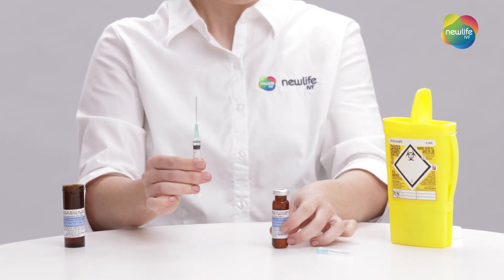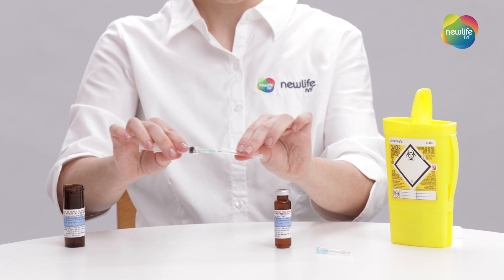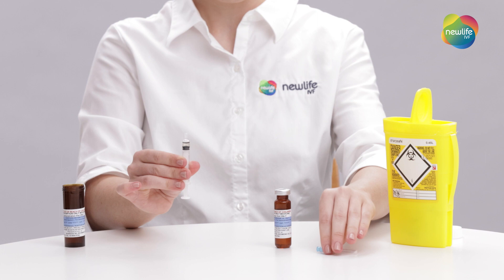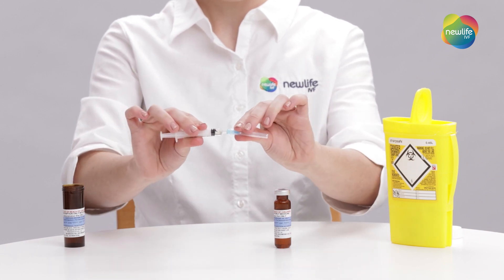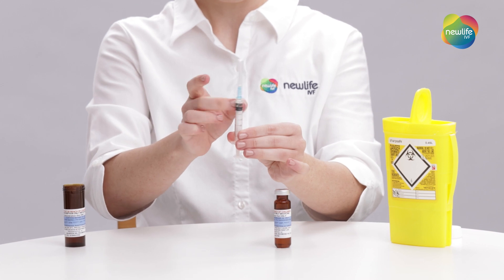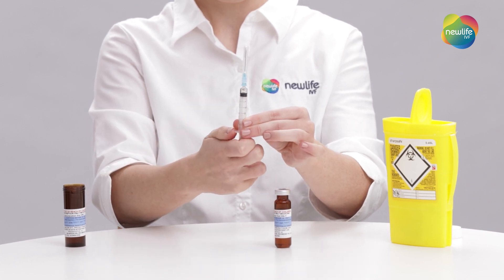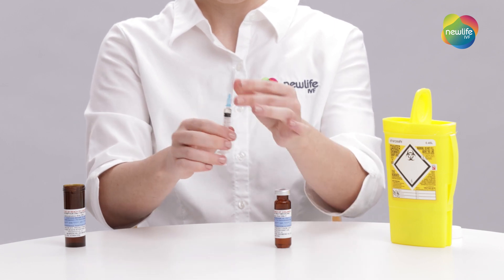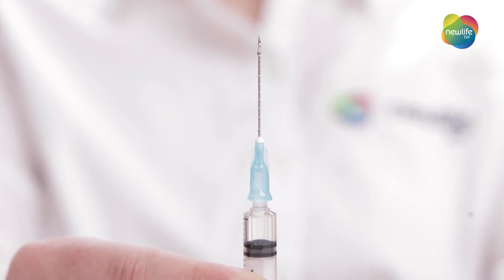Remove the drawing up needle from your syringe by twisting it off. Now you'll need to attach the 23 gauge administering needle. If you notice any air bubbles, you can flick the syringe and push up the plunger so that the air bubble is released into the air. It is preferable to have a droplet of oil appear at the very tip of the needle.